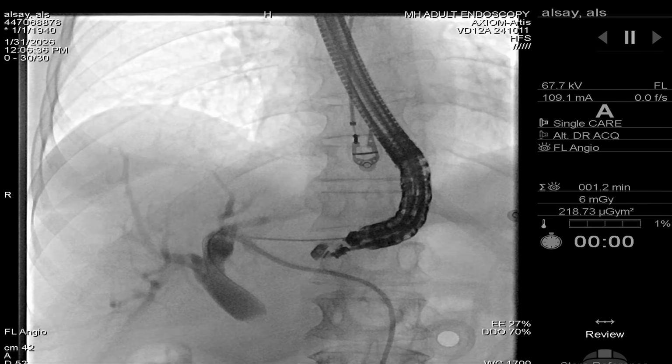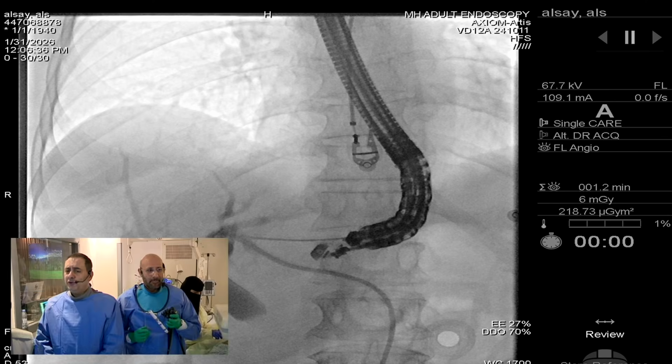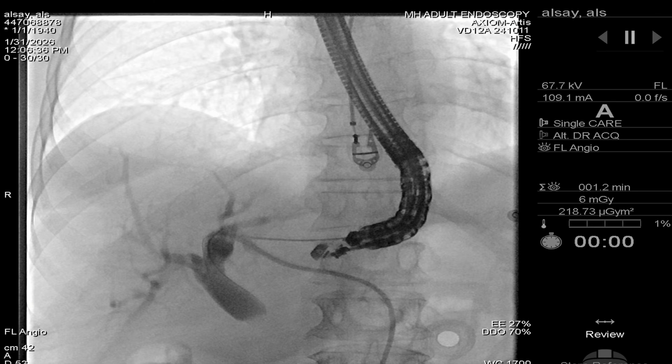Yeah, so we have this patient that had metastatic pancreatic cancer and came with obstructive jaundice and a gastric outlet obstruction. She had a GJ yesterday during the course, and today we're going to convert the percutaneous drain in the biliary tree with a hepaticogastrostomy. So in order to achieve that, when somebody has a perc drain, the biliary tree is decompressed. So the first thing we did was to inflate the biliary tree with normal saline.